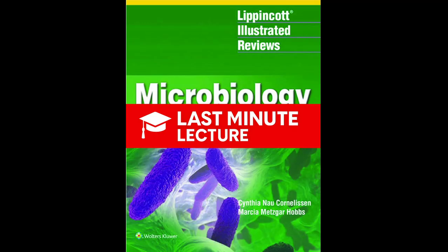Exactly. Then you add a chemical, a substrate, that the enzyme changes into a color. The more antigen there is, the darker the color gets. It's super sensitive. But even that has limits. Sometimes you have to go straight to the genetic code. Nucleic acid-based tests. Molecular. This is the real revolution.